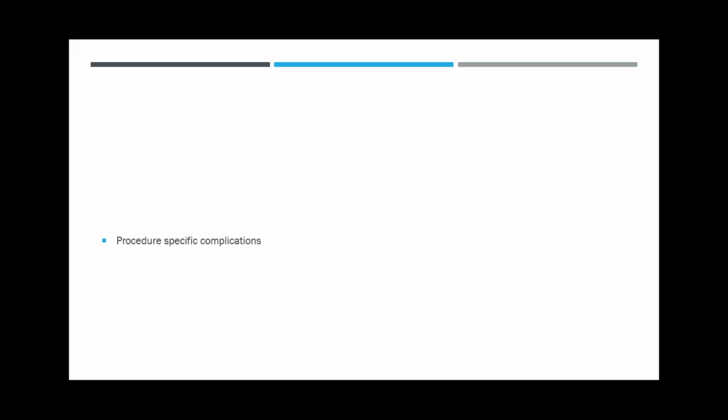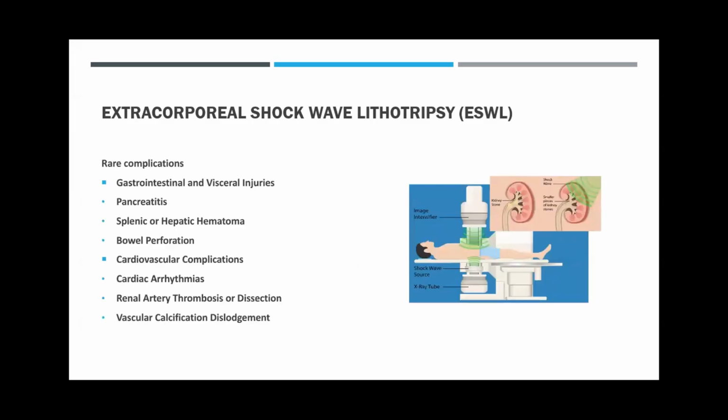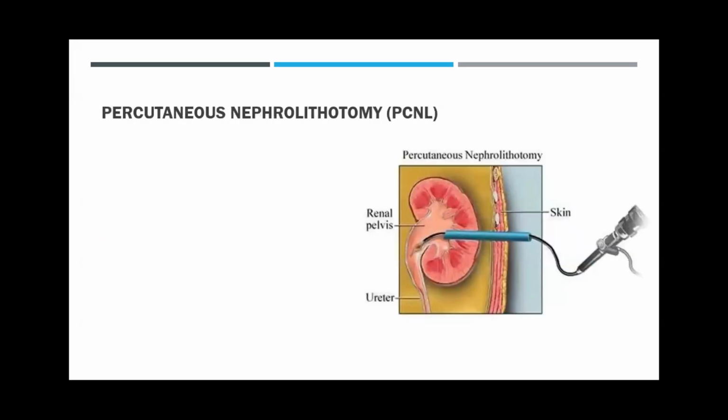Now I will jump to specific procedure complications. I'm not going to talk much about ESWL because my colleague just spoke about the complications a few minutes ago, and it can be in the short term or the long term. And he also spoke about the rare complications.